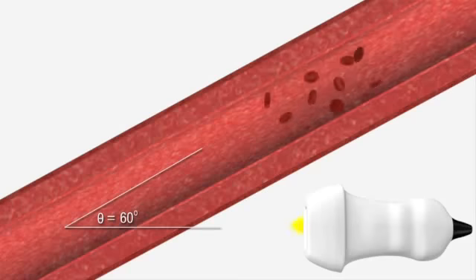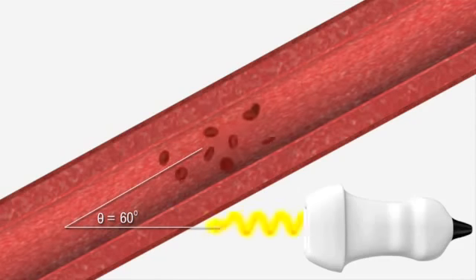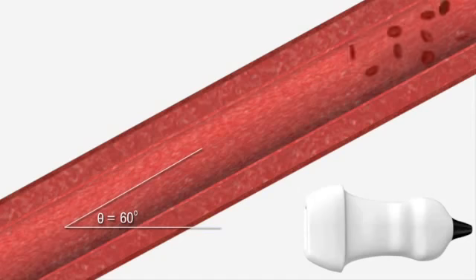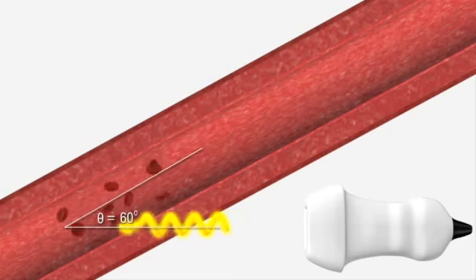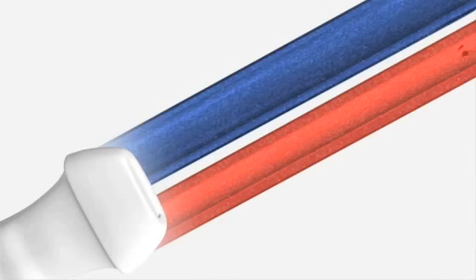To obtain the best Doppler images and detect the largest Doppler shift using ultrasound, the transducer must be placed at an angle of 0 degrees to the vessel of interest. However, due to practical considerations, an angle of 60 degrees is used. Color Doppler can distinguish when blood is flowing towards and away from the transducer.